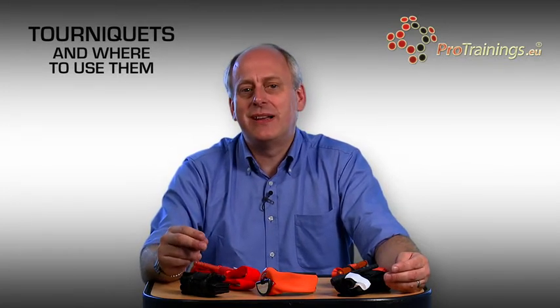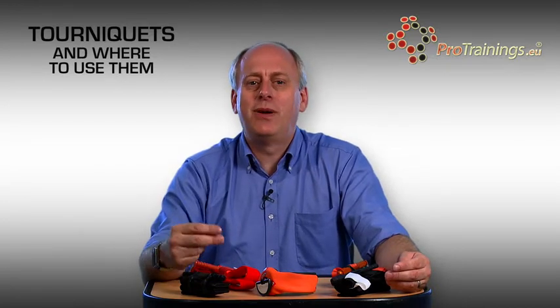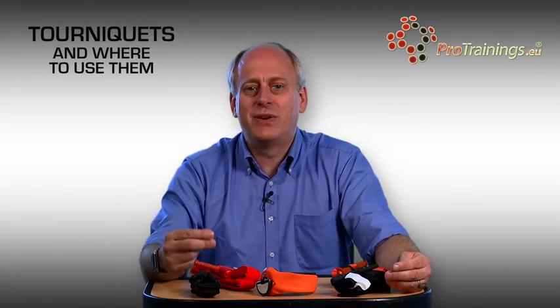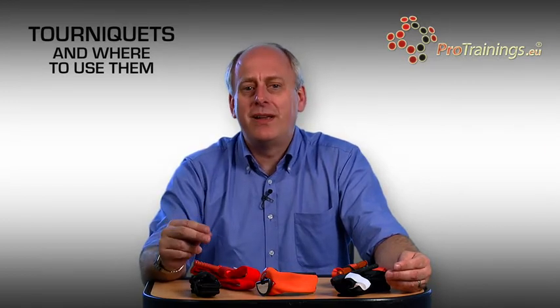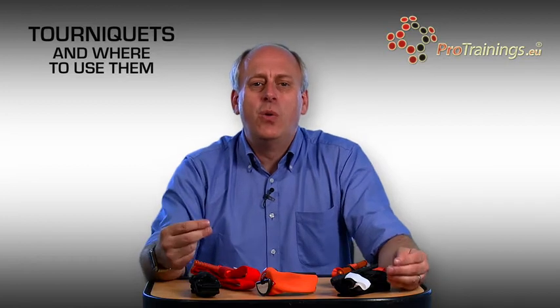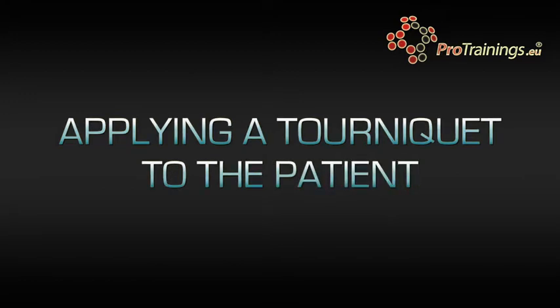When we apply a tourniquet, the aim is to block the arteries and the veins. The arteries are found deeper in the limb and the veins nearer the surface, so we need to apply the tourniquet tight enough to block the deeper arteries and not just the veins. Applying a tourniquet too loose would be life-threatening for the patient. When you apply a tourniquet, it will be painful for the patient and it will be hard for you physically and emotionally, but it's vital it's done quickly.